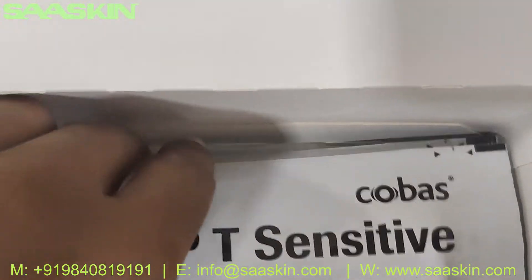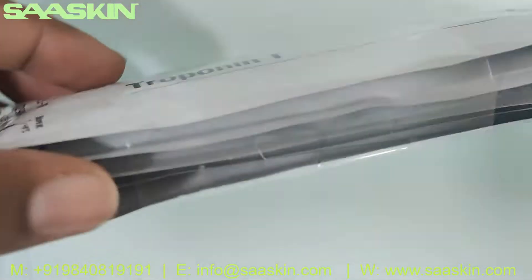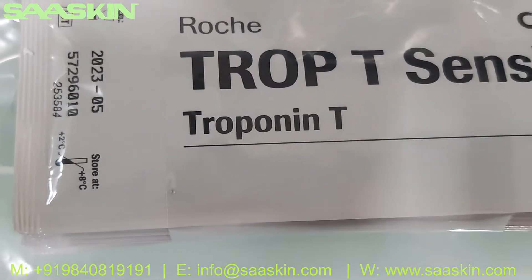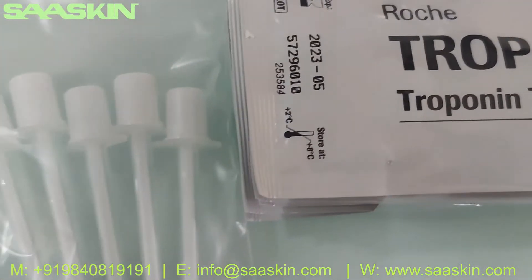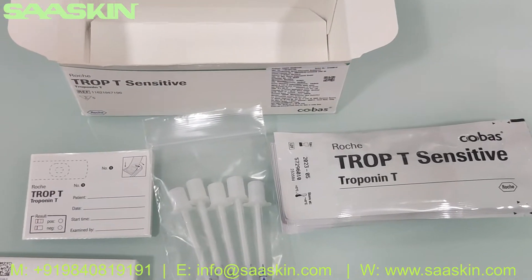Inside the box you have the test packs — this is how they come, wrapped up. The five test kits are here. This is the test kit pack, and it should be stored between two to eight degrees Celsius, which means it should be refrigerated.